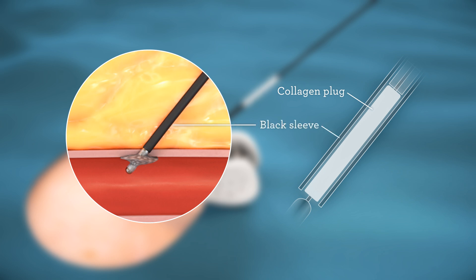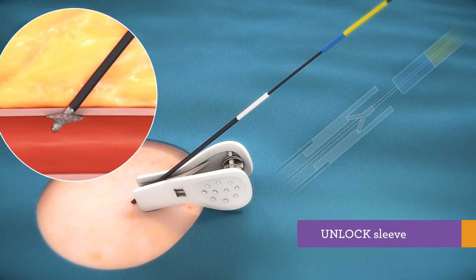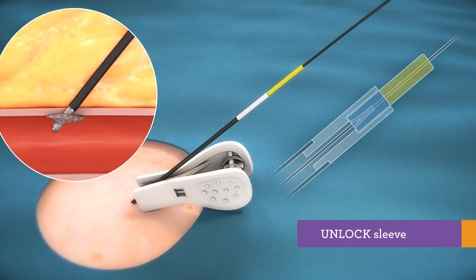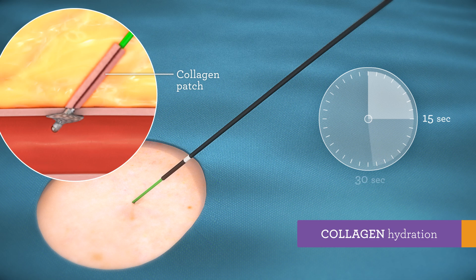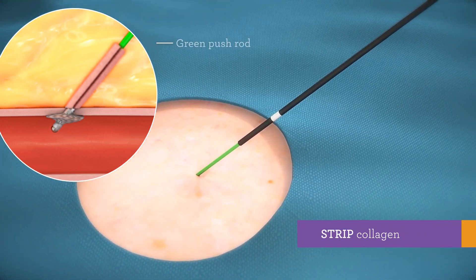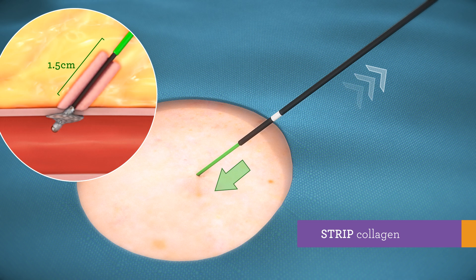The black sleeve with a proprietary locking mechanism prevents inadvertent collagen exposure. To expose collagen, remove clip and unlock sleeve by sliding yellow-blue key into lock until blue segment is no longer visible. Retract sleeve and allow 15 to 30 seconds for collagen hydration. Use green pushrod to strip collagen by maintaining gentle back tension on device while advancing pushrod one and a half centimeters down tissue tract and then retracting it. Repeat two to three times.